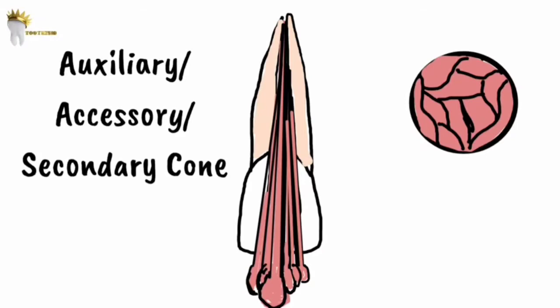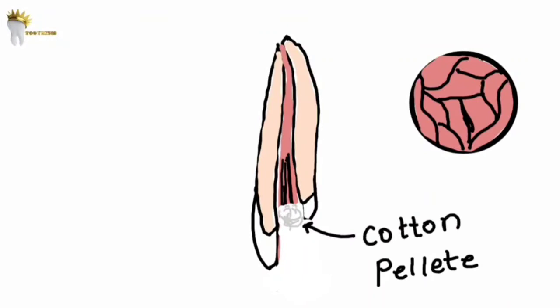After this, we will need a post-obturation radiograph. If the obturation is correct, finally the excess GP is removed with a heat carrier. The pulp chamber is cleaned with a cotton pellet soaked in alcohol to remove any leftover particles of the GP or sealer material.